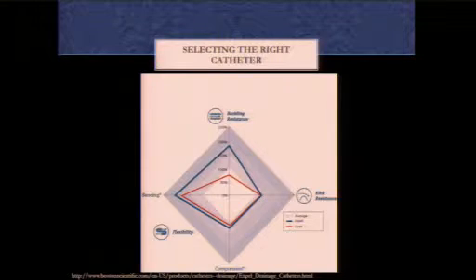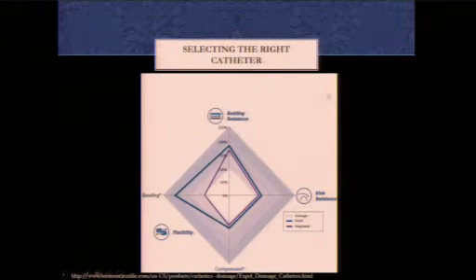So this is material published by Boston Scientific, so you have to take it with a grain of salt. But this is trying to say what the difference in the physical characteristics of the drainage tubes are. So if you have something that's more flexible, it's not going to be as buckle resistant, and it may kink. So kinking is when the tube bends, and then when you unfold it, it keeps that bent shape even though it's unfolded, whereas buckling is actual collapse of the lumen of the catheter, and flexibility is as it sounds.